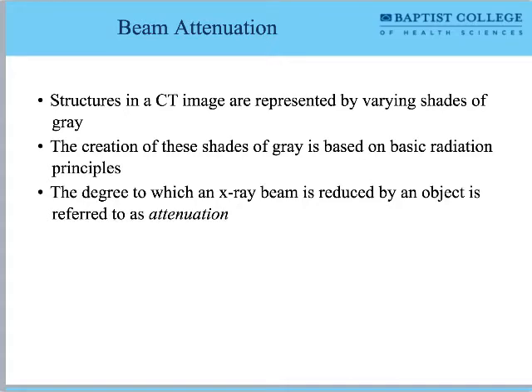Another way to think about this, the simplest way to think about this, is: what did you have to start with and what did you have at the end? Between the two of those is a picture. What you had in X-rays to start with and what you had in X-rays at the end, between those two is a picture. It's a ratio. It's a statistic, in other words. Can you say absorption? Absorption is another way to talk about this, yes. The physics nerds will probably be trolling this video at this point, but yes, I'm fine with you saying absorption.